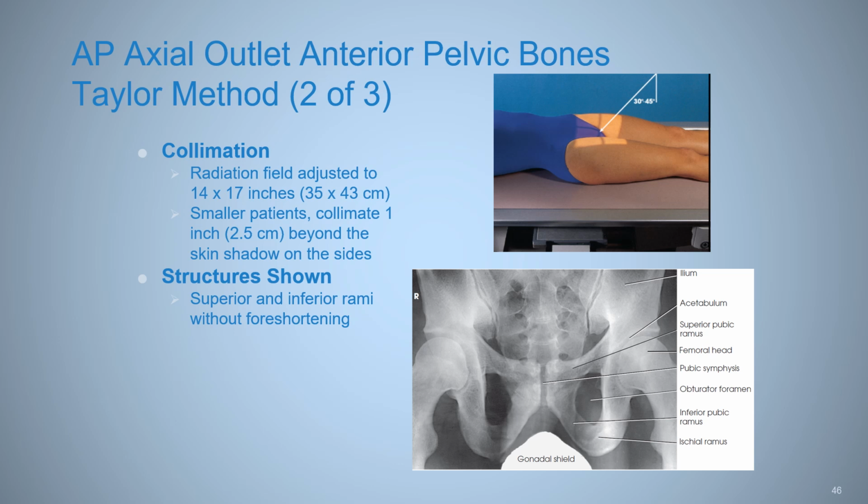And they're showing this with, so this doesn't match up to the patient that we have up here. The patient is a female patient. This is a male radiograph because they have a contact shield on the male gonads at the bottom of this labeled radiograph. This labeled radiograph would be a good one for a quiz, so be mindful of that. Okay, so pubic symphysis, superior pubic ramus, inferior pubic ramus, ischial ramus. Can't really make out the tuberosity. That's more self-superimposed over the ischial ramus.